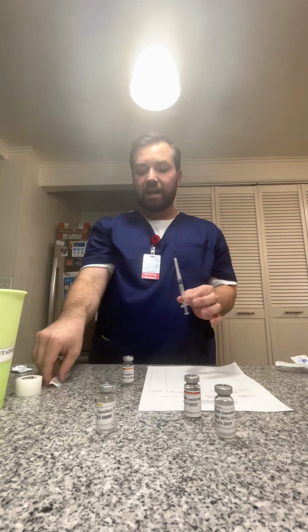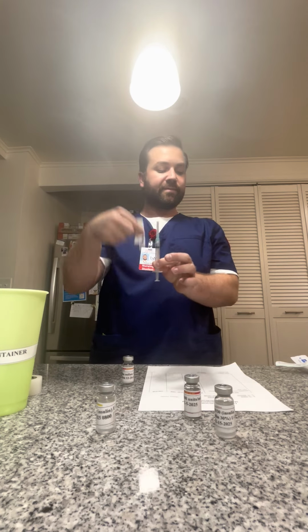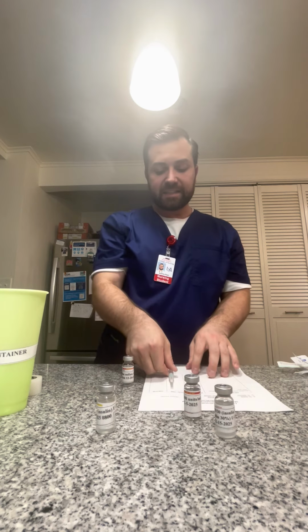I'm going to put my arm behind my back, and we're going to do the scoop method. All right, and now I can apply my clean needle. Now I can take the blunt tip cannula off and place it in my sharps container. Now I can apply my clean needle. All right, and that can go in the trash, and I'm going to set that here.